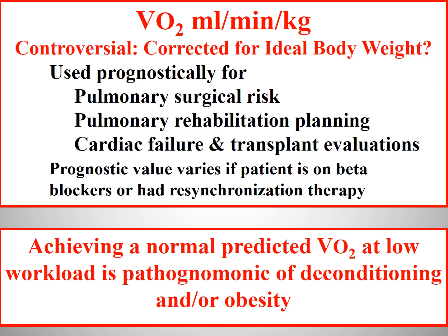If one is using a cycle ergometer incrementally increasing the wattage on the pedals, it is not measuring the wattage from the additional body mass. For example, if someone is 150 pounds overweight, that's approximately 4 extra suitcases they are carrying on their body and their legs, and the cycle ergometer is not recording that additional workload.